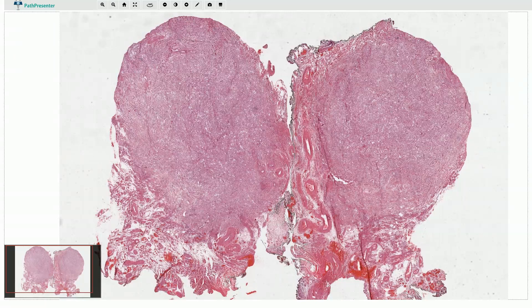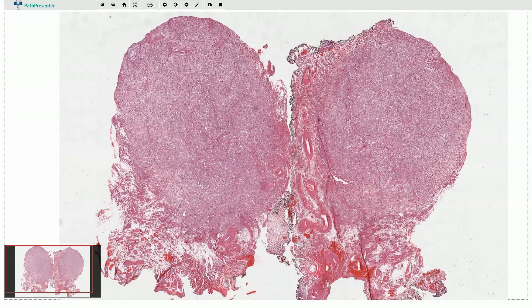This is the case of adenomatoid tumor. It is a benign tumor of mesothelial origin. Both men and women can be affected. If it affects men, it is commonly a paratesticular tumor, as is also the localization of this case.